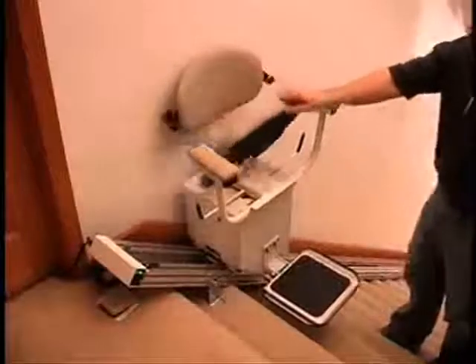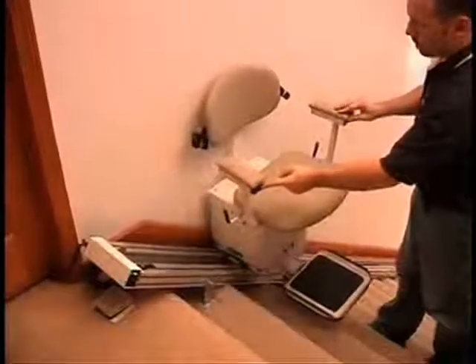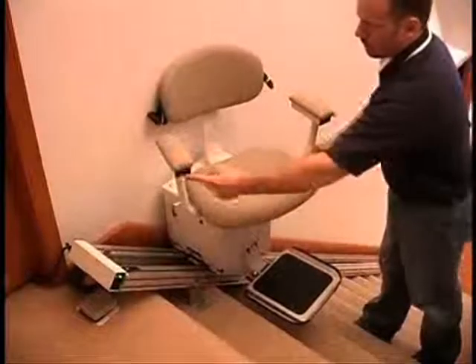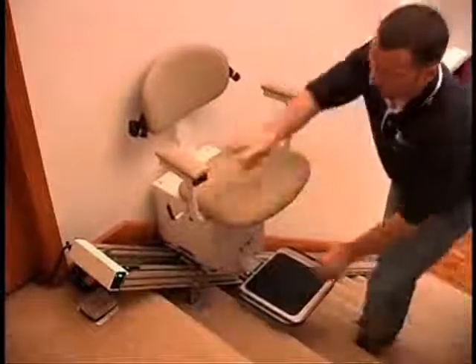Now it's time to test your work. Without sitting on the unit, use the armrest controls to run the unit short distances in both directions. The lift is designed so it will not run unless the seat is facing forward and the swivel lock is in place.